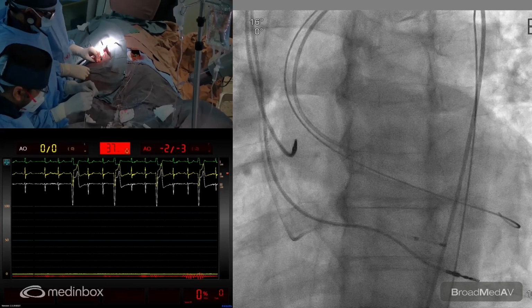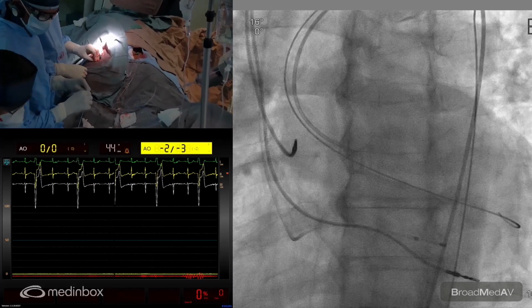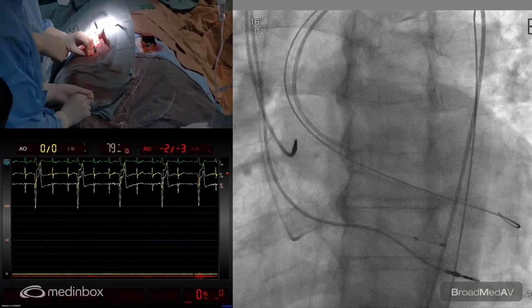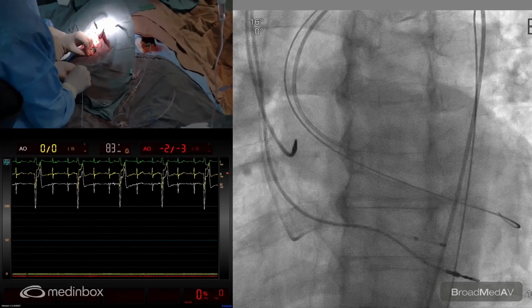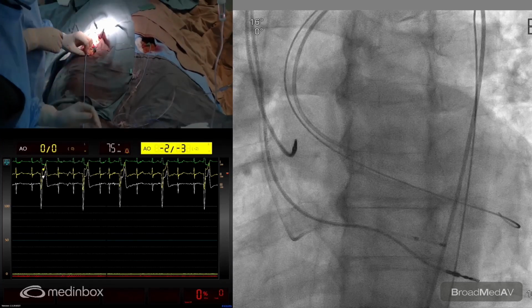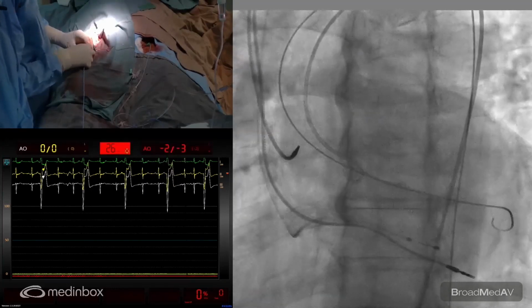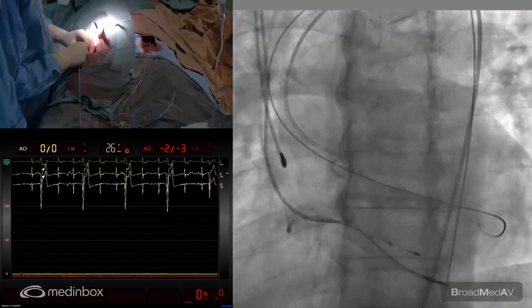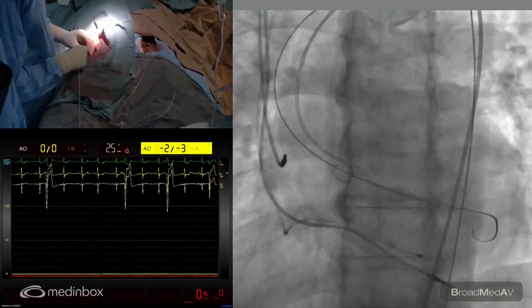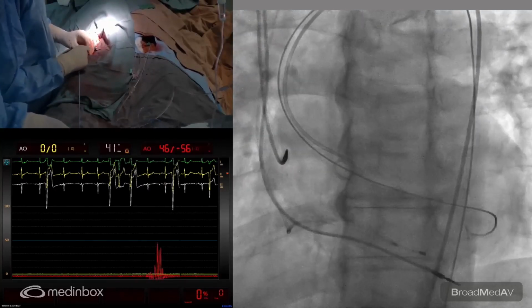So we've got a wire in, it's a soft Teflon wire, and now we're going to put the pigtail, which will help us keep it straight to get the Safari in. Ravi sir gave a 3-way. Again, be very careful with both the pressure wire and the sheath as you go in. And there you're in control.